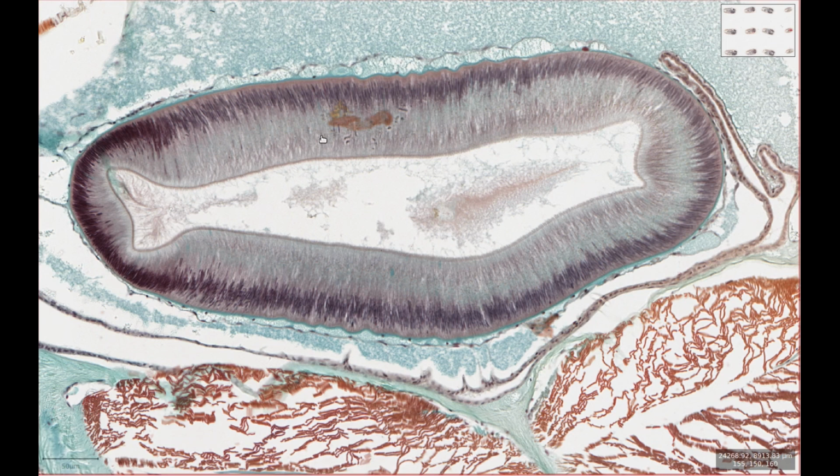So that's all of the major features that Amphioxus has in the intestinal tract that we can see on this slide. I hope it's been interesting and that you've been able to follow along on the digital slide on the website.